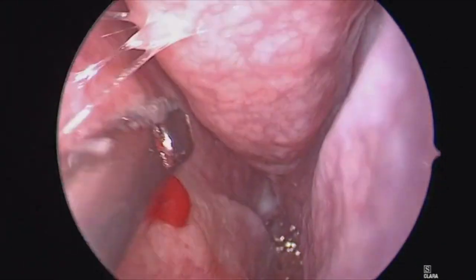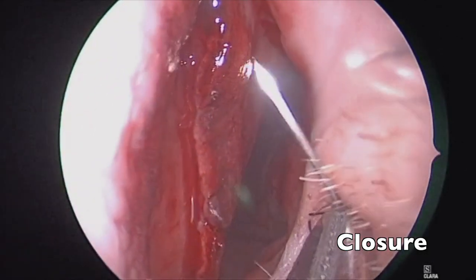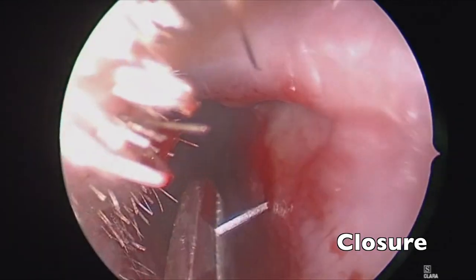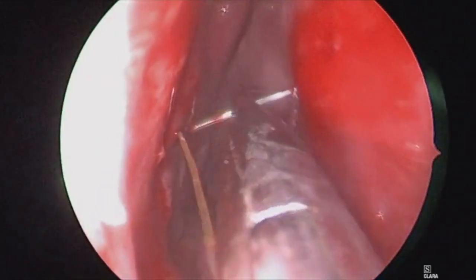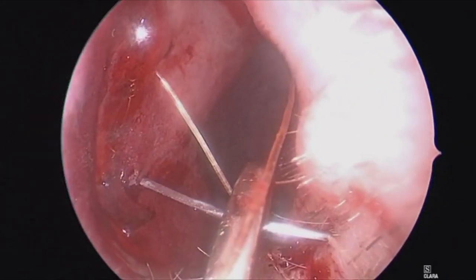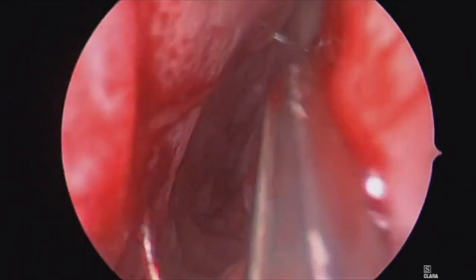At the end of the case, re-examine the patient's nasal airway and ensure that you're satisfied with it prior to closure. I typically will close in a quilting fashion with a 4-O Keefe needle. Here we are going just behind the incision, crossing the septum, and then coming back in front of it to close the incision, continuing to quilt more posteriorly. This is an absorbable stitch passed through and through, pulling that mucosa right up to the edge of the incision to ensure that residual cartilage is nicely covered. We go back and forth a few times to help close dead space and then tie it off in the patient's left nasal cavity.